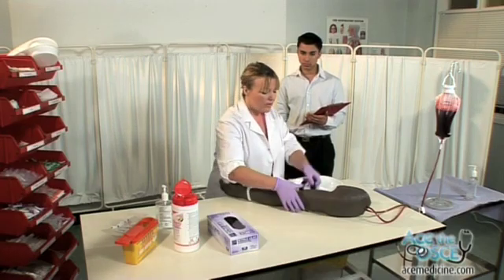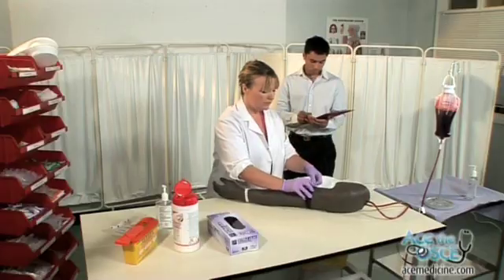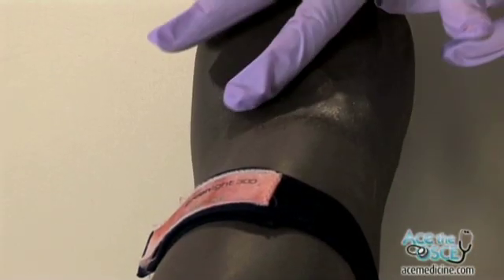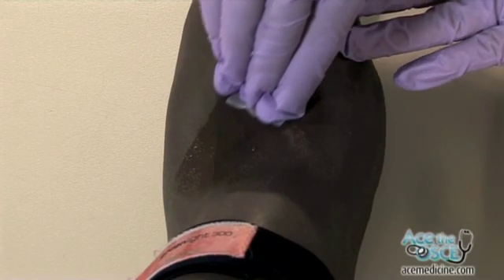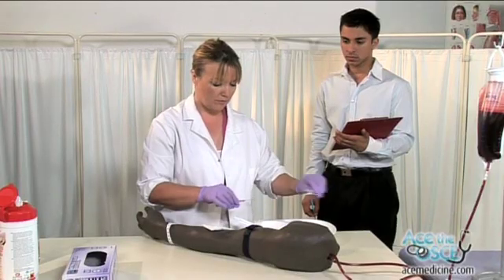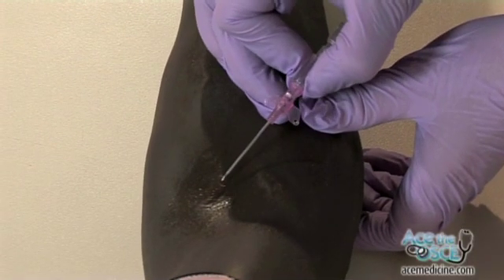Return to the patient. Sir, this may feel a little tight. Apply the tourniquet above the antecubital fossa. Find a suitable vein. Clean the skin using the alcohol swab. Warn the patient of a sharp scratch. Sharp scratch, sir.